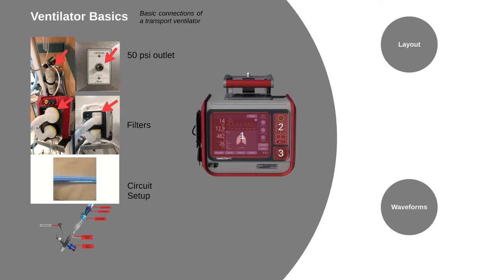All right, now this is the face of the ventilator. I've divided it into three sections, the one being the LCD screen, two being the hotkeys that provide a little bit of quick actions, and three being the rotary knob, which allows you to navigate the LCD screen.